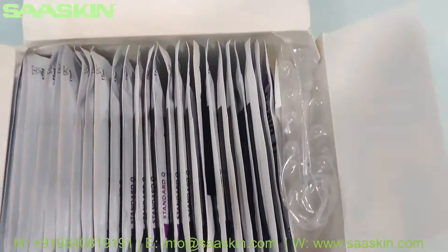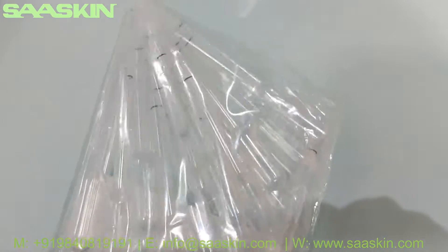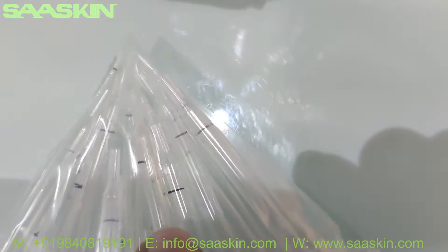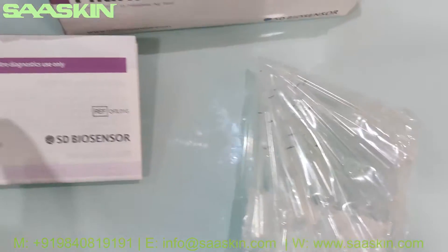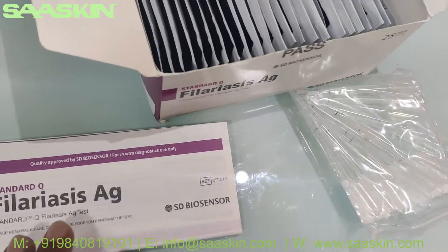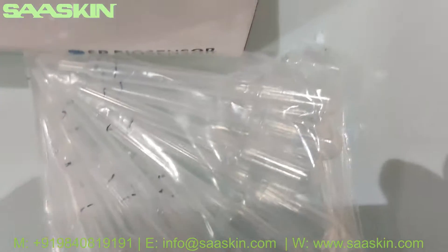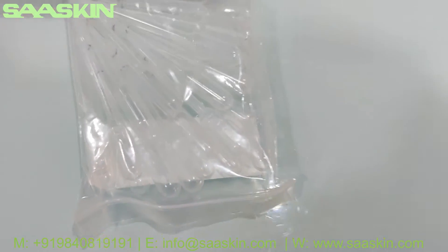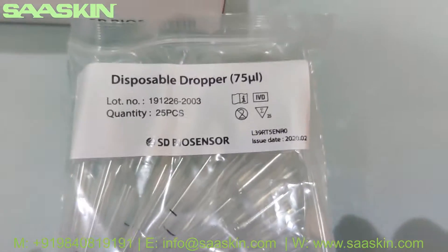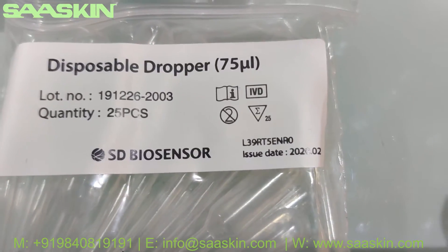Inside the box there is a dropper, and this dropper has a black line mark. If you go through the instructions you will know how to refer to that mark — when you take your sample it says you should take it up to this black mark. In this box you get 25 droppers.